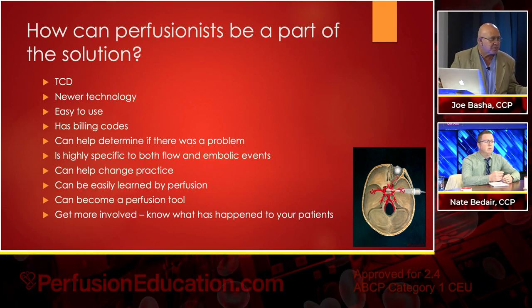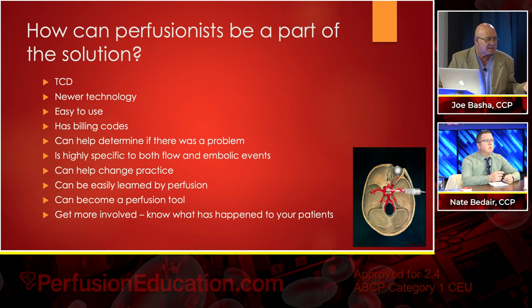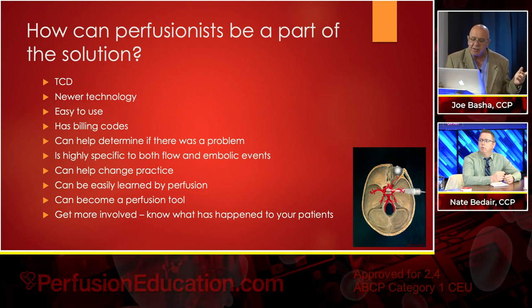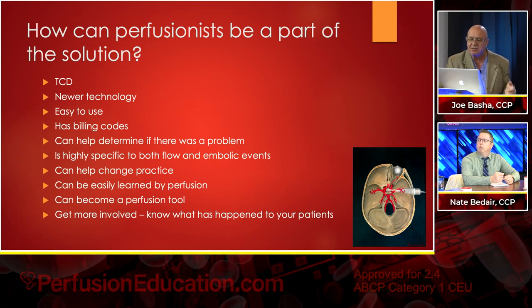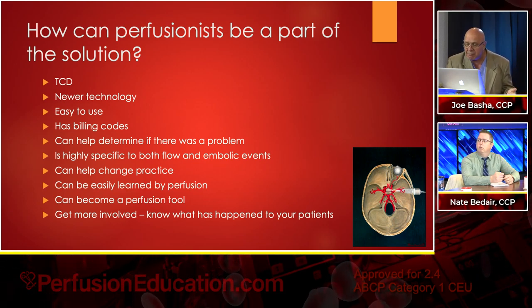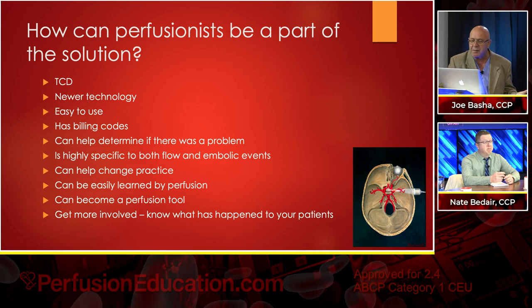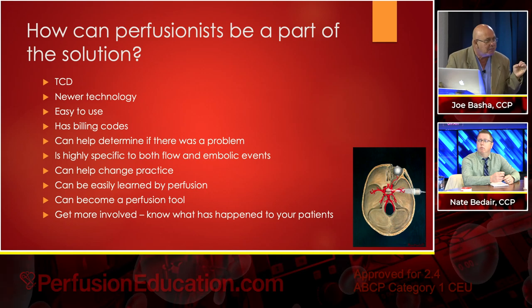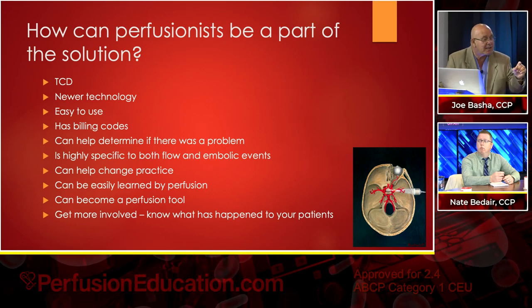There are some issues associated with it, and you're dealing with real estate. I'm gonna show you an image of why I think there may be a limitation to this. But there are some newer technologies that are easier to use. They do have billing codes, so it does help as far as payments are concerned. Can help determine if there was a problem. It can't prevent a problem in that case.